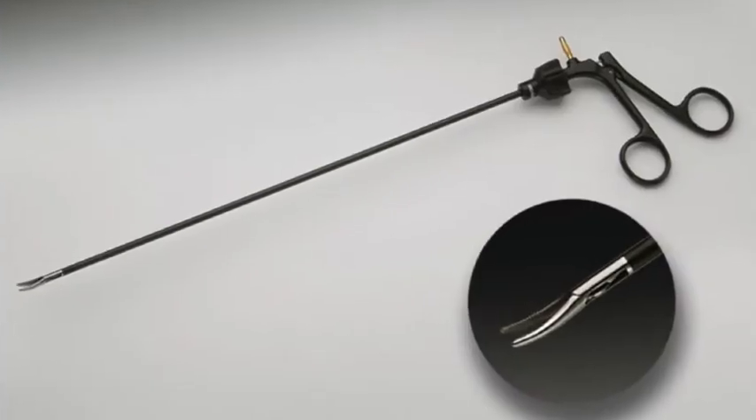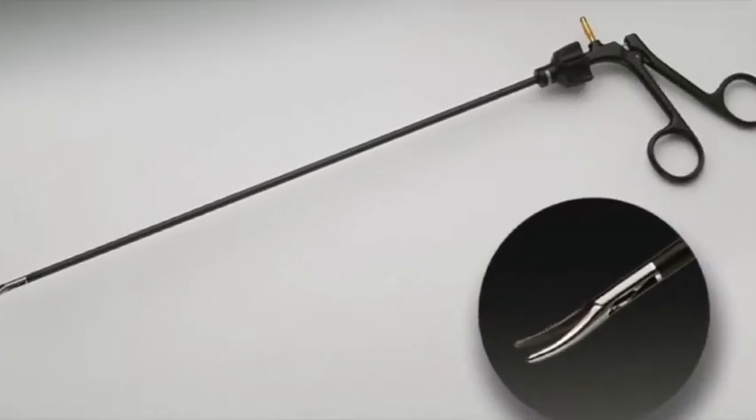Our workhorse in endoscopic cases is the Maryland Dissector. We use it for cutting and dissecting, but also for grabbing different organs. This is the instrument that if you don't know anything else, grab the Maryland and get it on your Mayo stand.